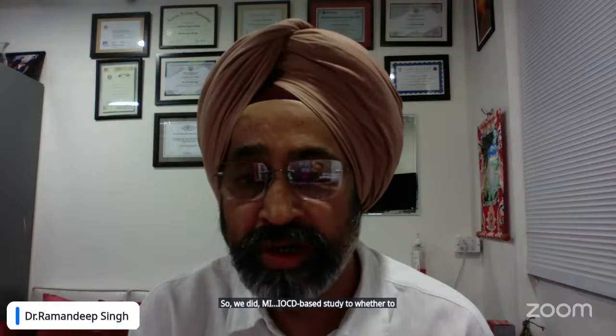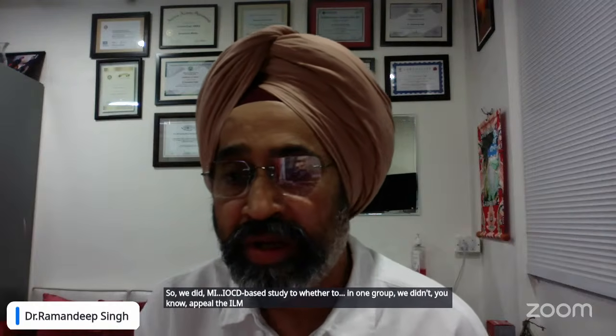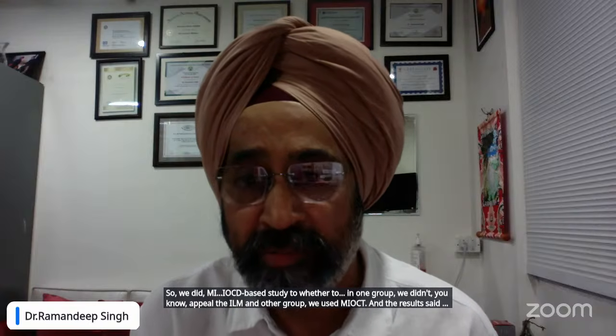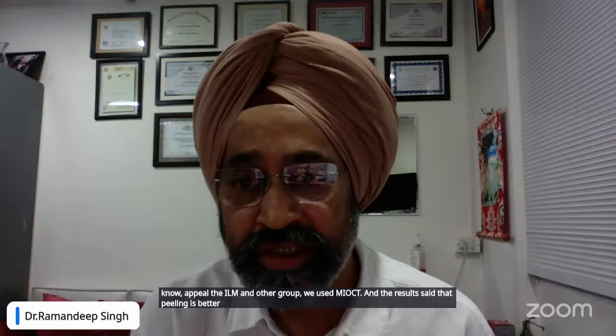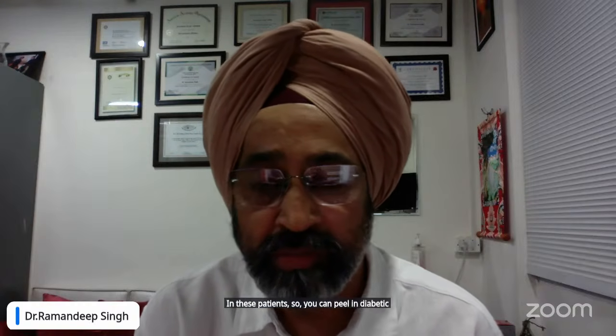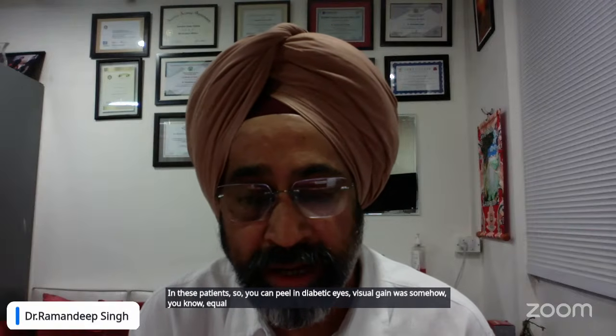In one group we didn't peel the ILM, and in the other group we used MIOCT, and the result said that peeling is better in these patients. So you can peel in diabetic eyes. Visual gain was somehow equal at 3 months.